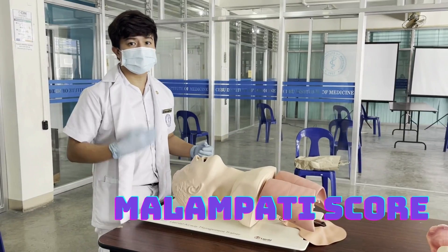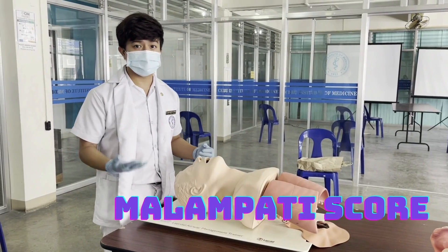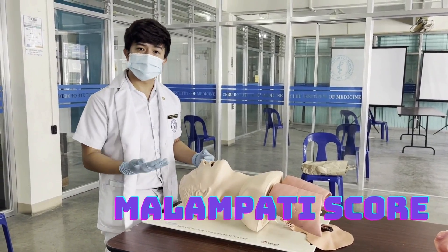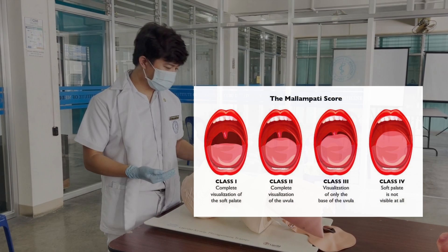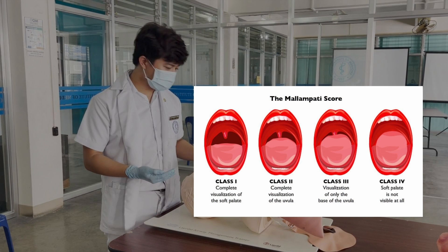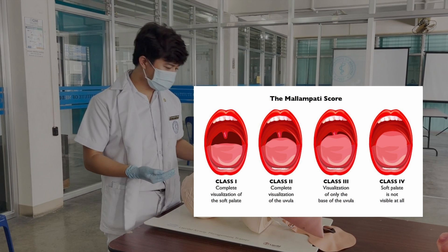Third, we assess the Mallampati score. Ask the patient to stick out his tongue and assess the oral cavity. The higher the grade, the more difficult the intubation.